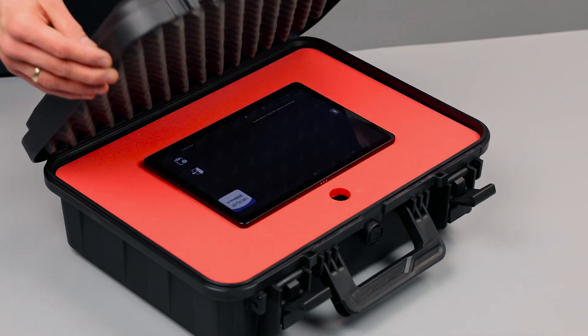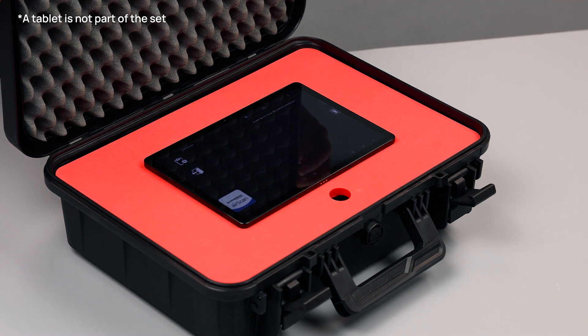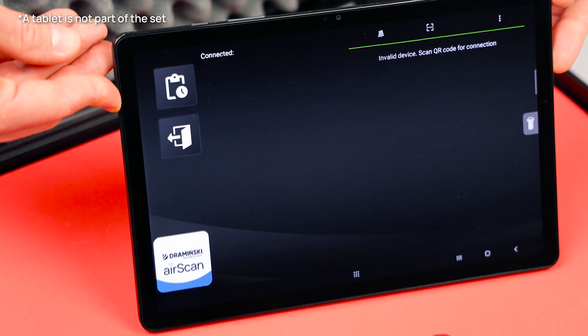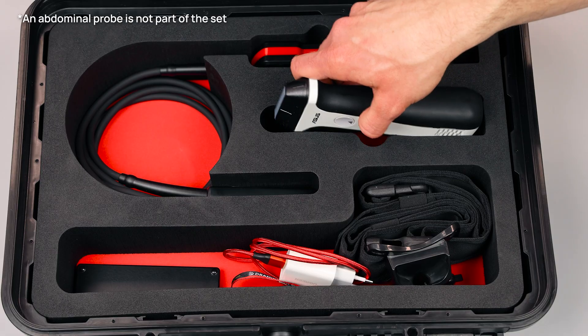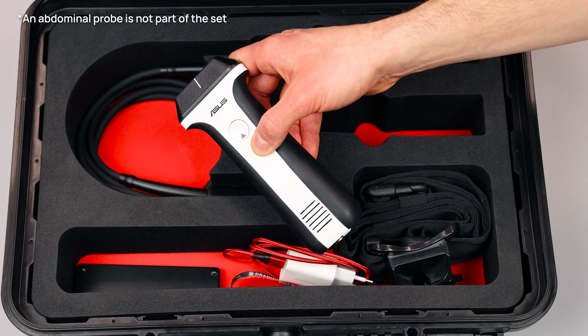A handy case provides a secure place between foam inserts for a tablet that can be connected to AirScan Pro using the free app available for Android and iOS systems, and a dedicated space for an additional abdominal probe.